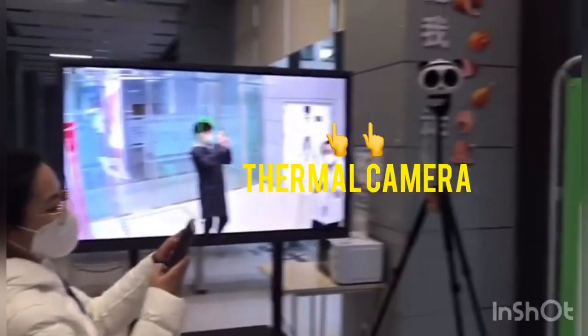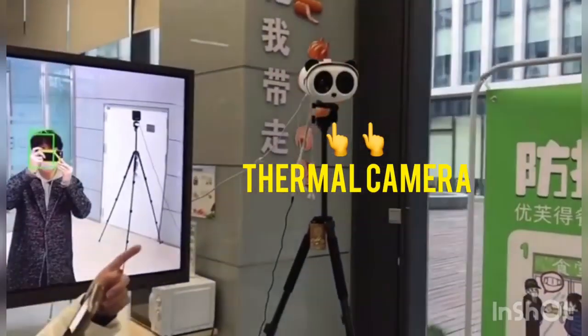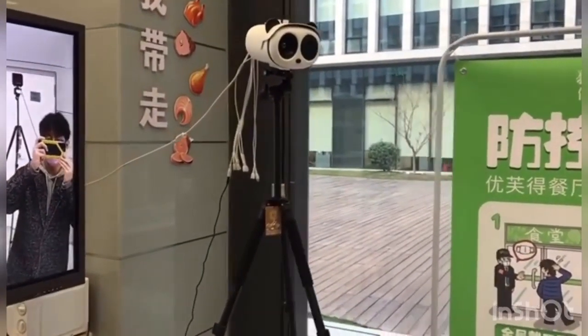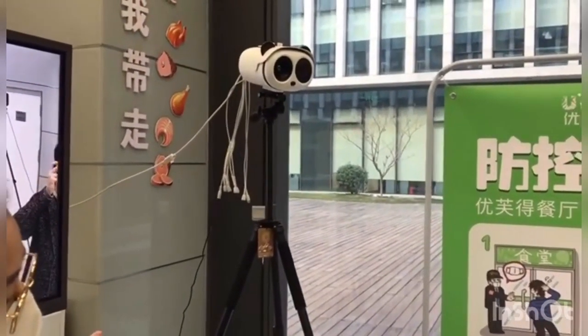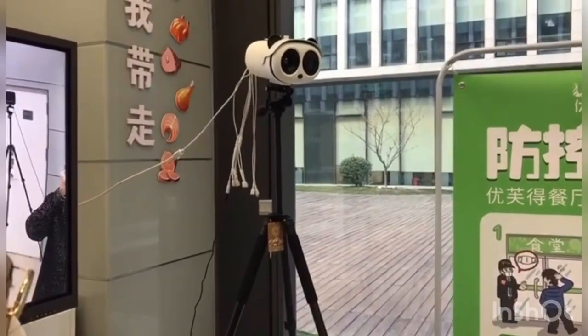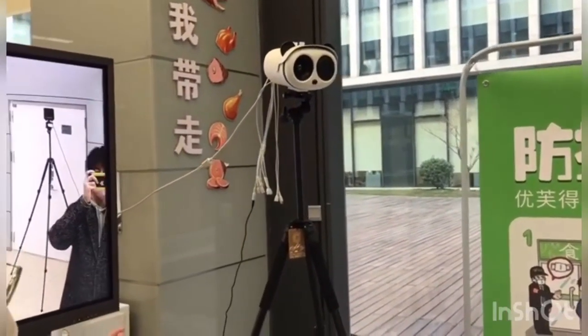This is the camera. It's called the human body thermometer. The temperature measurement accuracy is less than 0.3 degrees centigrade, and the temperature targets can support up to 16 at a time.